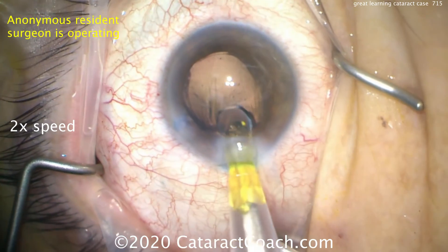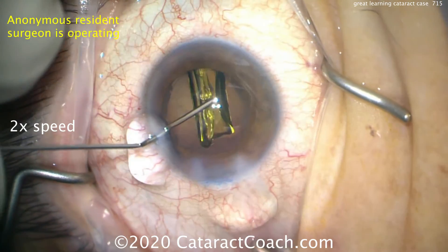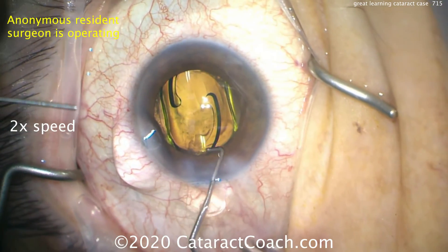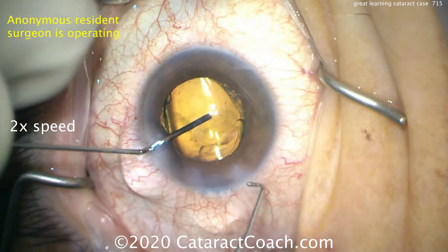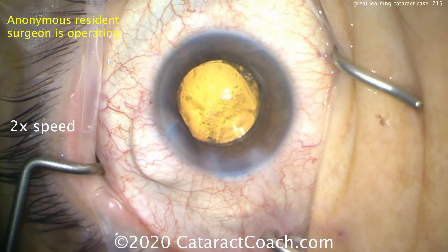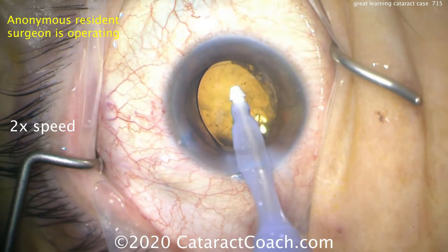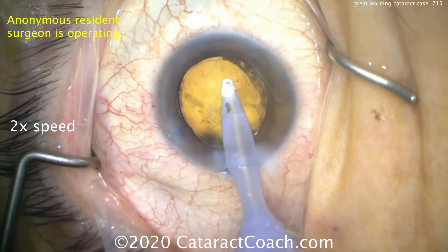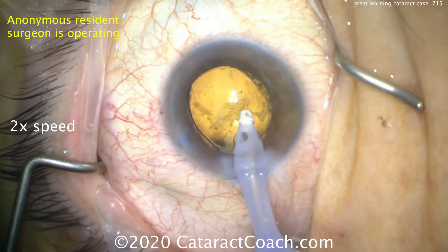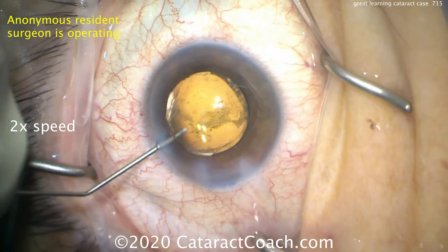Here's a single-piece acrylic lens loaded up and being delivered right inside the eye — a little bit of counter traction there. You're asking yourself how there are three hands here: the side port cannula is me giving a little assist because the resident had two hands on that twist-style injector. Now the lens can be fully opened up, and what you thought was a huge rhexis is actually perfect — that optic is six millimeters, and you can see it's overlapped 360 degrees by the capsulorrhexis, making it about five to five and a half millimeters. Removing viscoelastic from the eye. If you've only done 40 to 50 cases, it's okay to just tilt the lens to remove viscoelastic — you don't necessarily have to go behind the optic. That's a tougher move for a novice surgeon, and you'll get there.